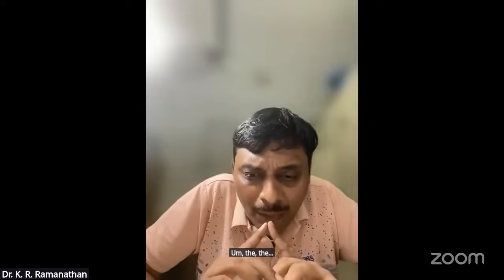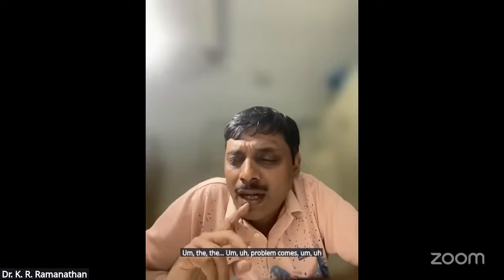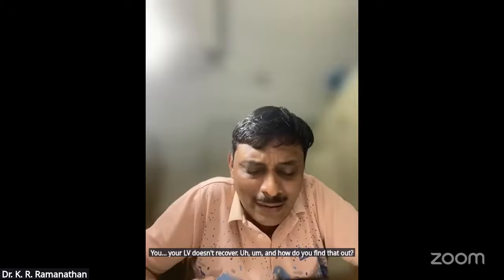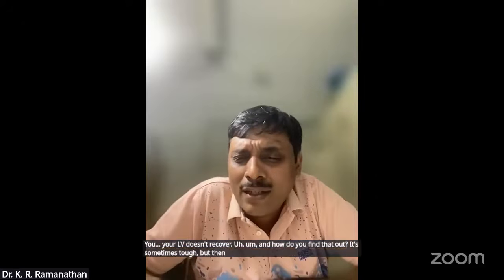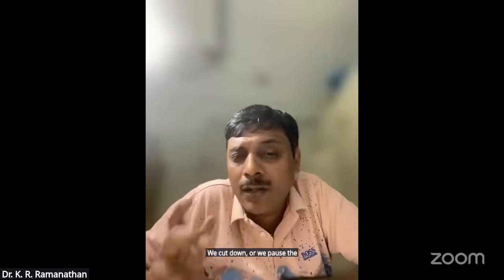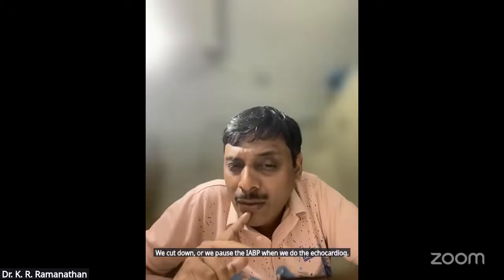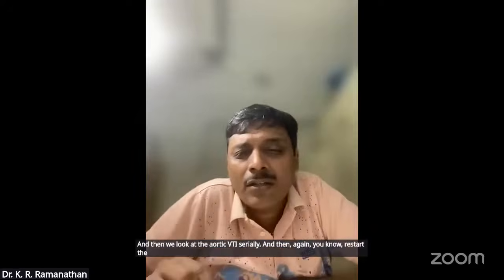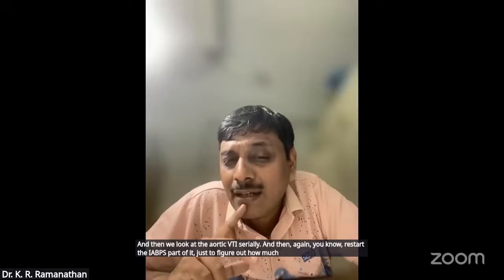The problem comes with unloading when your LV doesn't recover. And how do you find that out? It's sometimes tough. But what we do on a general basis, say the patient is on an IABP, we pause the IABP when we do the echocardiogram, and then we look at the aortic VTI serially, and then again restart the IABP, just to figure out how much the LV has recovered.